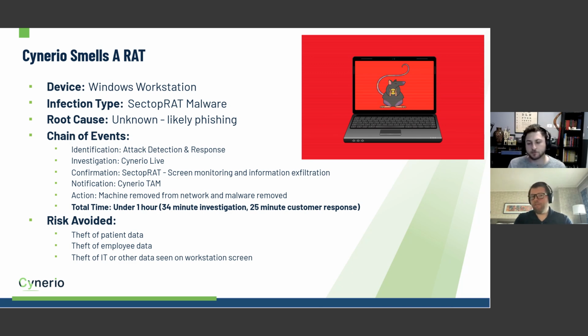Great. And then one other, why wasn't this caught by firewalls or other technologies? Well, it's a good question. It depends on what exact firewall or security device they would have. We work with a lot of different hospitals that have standard security solutions, and they're great for finding things that are more IT focused. But as soon as you have a device that is involved with clinical functioning, its profile already looks a little bit different than you would expect a normal machine to look. And so it tends to flag false positives. It tends to not alert on things where it should be alerting. Whenever you have a device that is medical or medical adjacent, you really need a dedicated security solution in order to find these kinds of things.